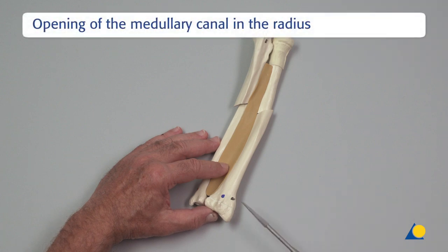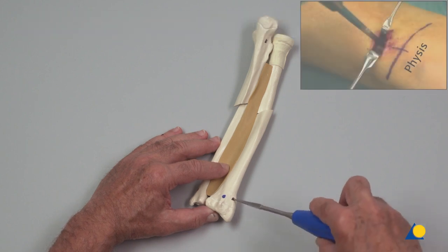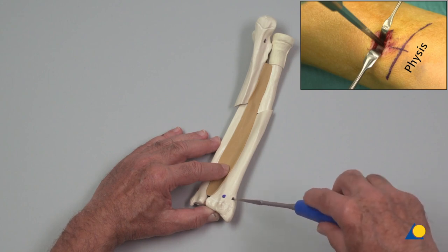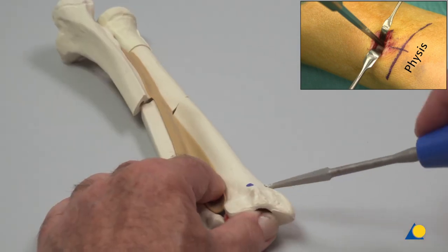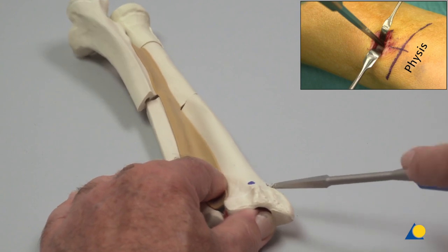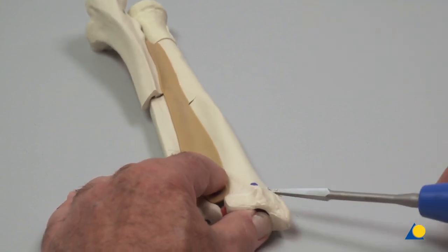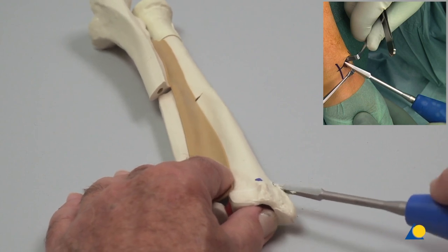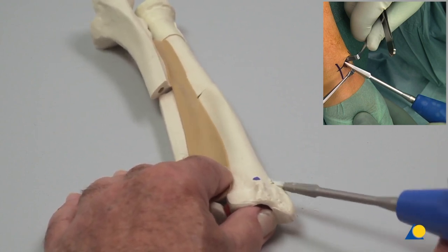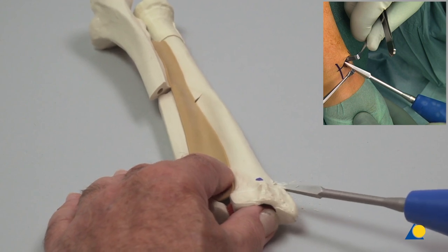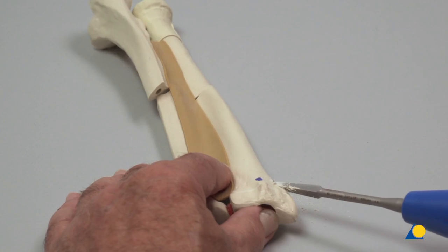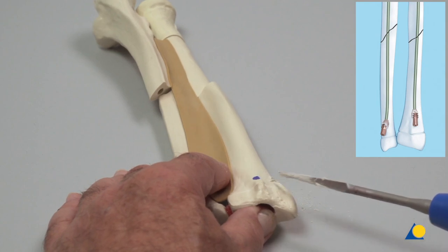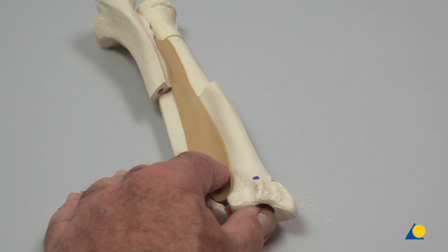The awl is inserted perpendicular to the bone and a central mark is made with oscillating movements. The awl is advanced into the metaphysis with full rotational movements. Once the awl has secured a purchase in the bone, it is lowered to an angle of 45 degrees in relation to the shaft axis and the bone is perforated at an upward angle. The entry point opening must be slightly larger than the selected nail diameter. When using end caps, the holes must correspond to the core diameter of the end cap. It is crucial not to penetrate the opposite cortex.